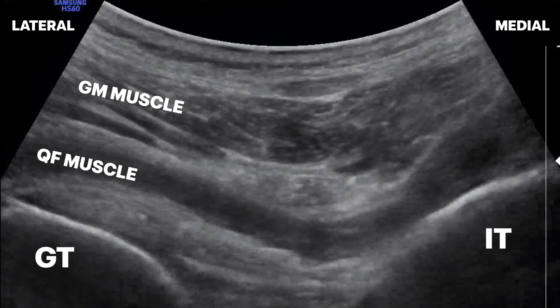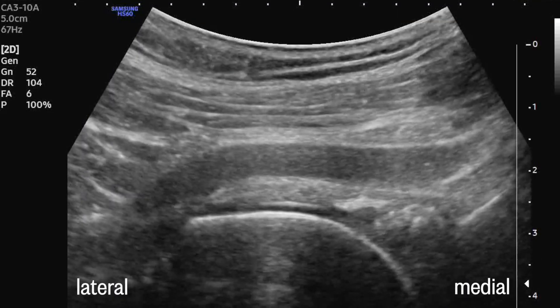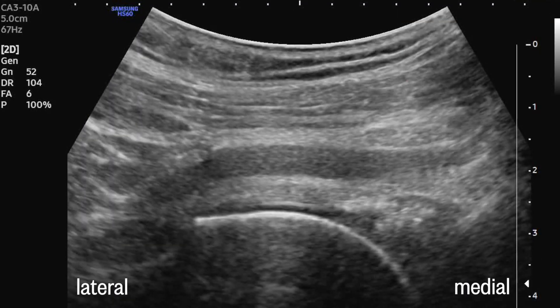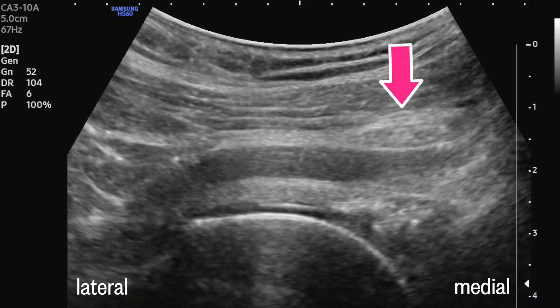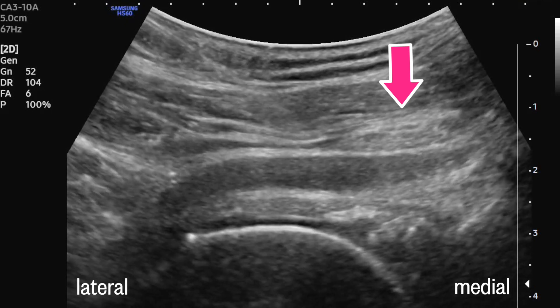Here's what our sonogram looks like. We see the hyperechoic bony prominences on either side and the oval or triangular sciatic nerve sandwiched between the gluteus and the hammock-like quadratus. Here we see the greater trochanter on the lateral side and the hyperechoic sciatic nerve nicely sandwiched between the two muscles.